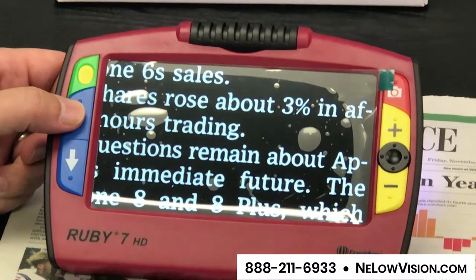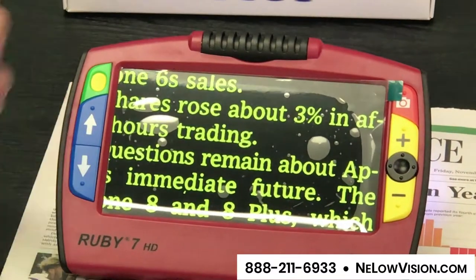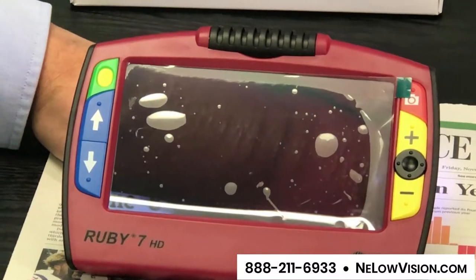That's the enhanced negative mode. We also have enhanced positive. And back to full color — you can see the color of my skin there.